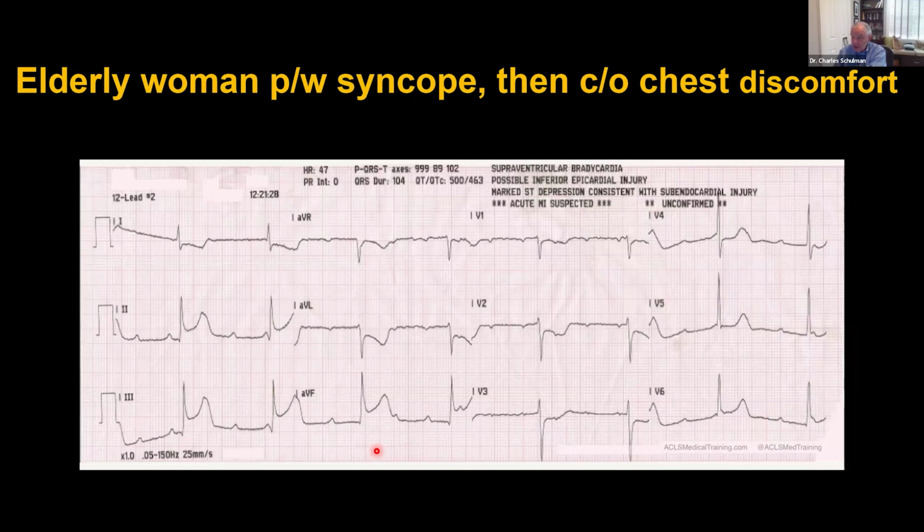That's different for anterior MIs. In anterior MIs with heart block, it's usually due to the size of the infarct as opposed to AV nodal ischemia. So if this person got a stent in their right coronary artery, the heart block would go away.